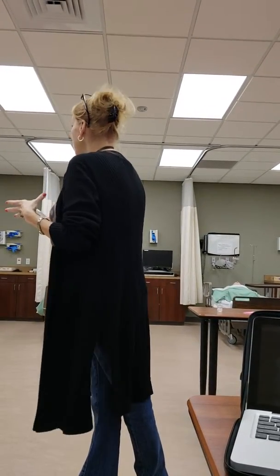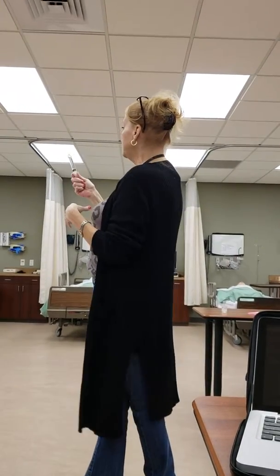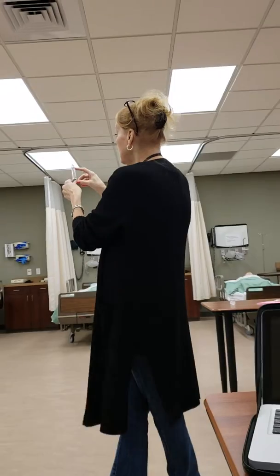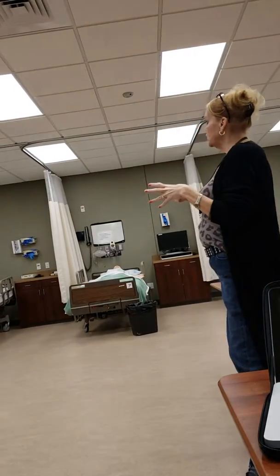Back in the day when we gave Phenergan IV, it was 12.5 milligrams in 10 mLs. So it had to be in a 10 mL syringe. And of course, when you have a 10 mL syringe, you still have enough pullback to be able to put a half a mL of fluid in there. So certain medications do require that whole 10, but for Pepcid purposes, we're going to do 3 to 5.